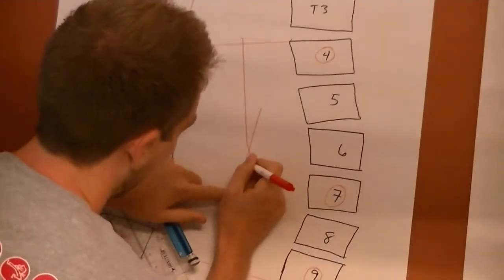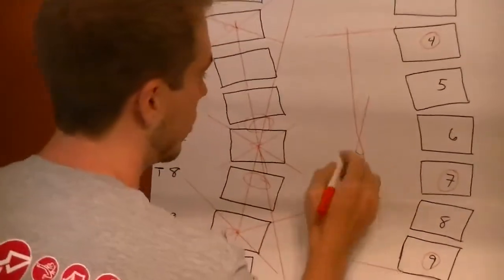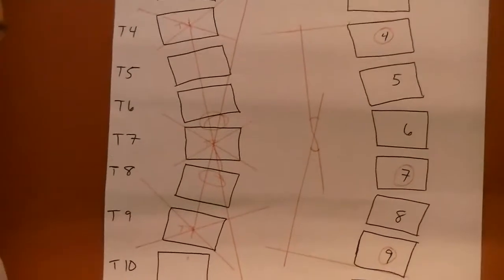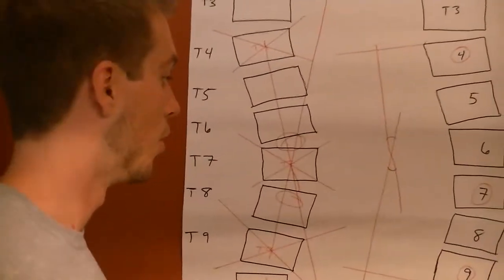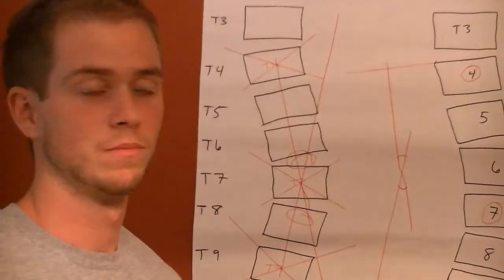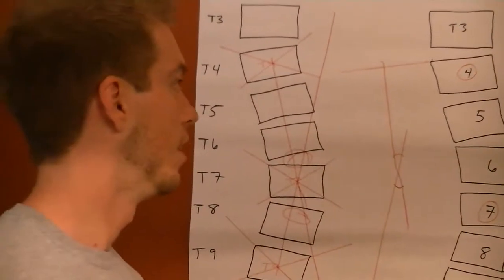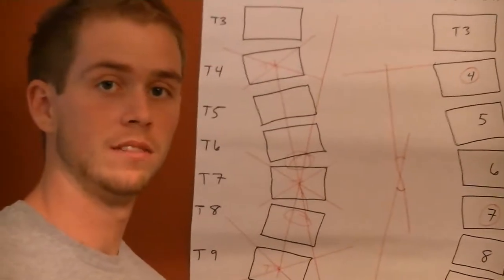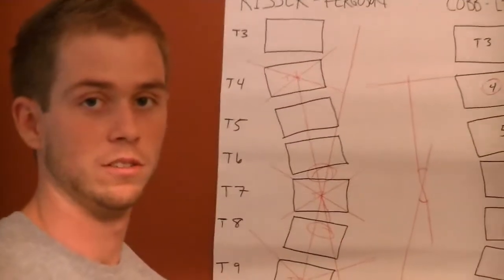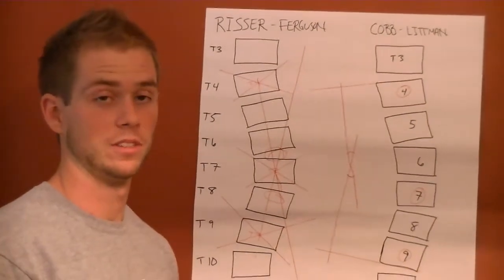But this right here is the angle that you're going to measure. So you take your protractor and you'll measure this angle or this angle, either one. And if it's between 0 and 20, you want to observe it for progression. And progression is a 5-degree change within 3 months. If it's between 20 to 40 degrees, then they recommend that you have some sort of bracing. And if it's greater than 40, they typically recommend surgery. So we don't necessarily have to go by these, but we need to know them for the test and for boards.